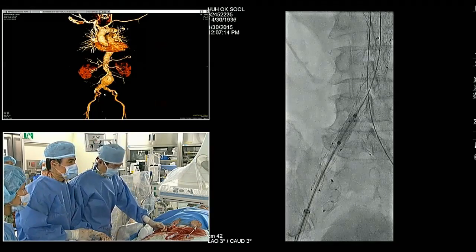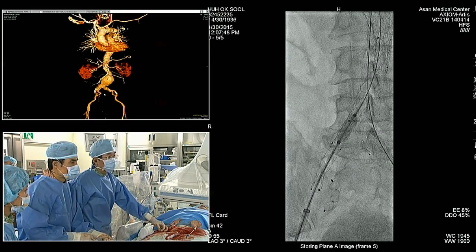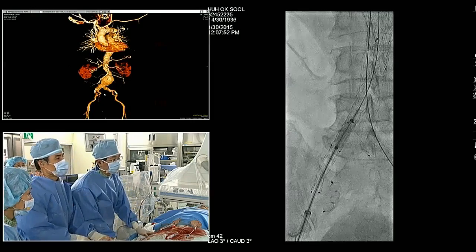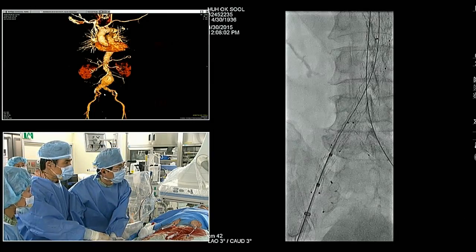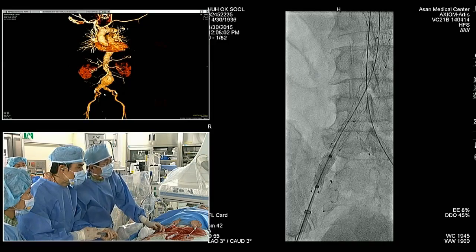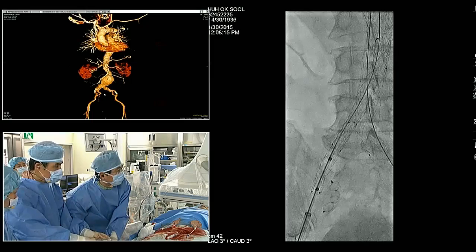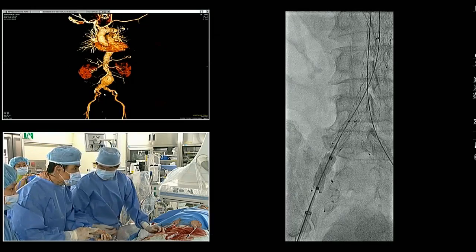During the device inside the body, I cannot check that. So he's doing brief inflations just to take out any fabric folds or kinking. There's not really any stenosis in this anatomy of any significance. There, where he transitions to the external, it's just a smaller diameter. A little bit more lower. One more time.